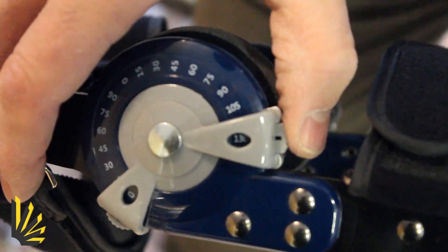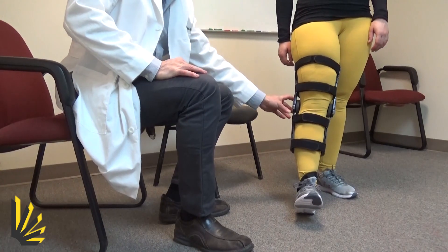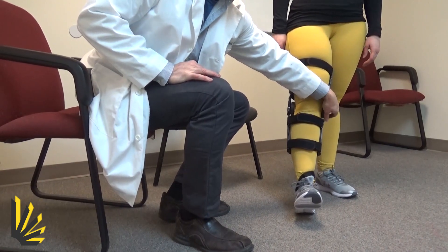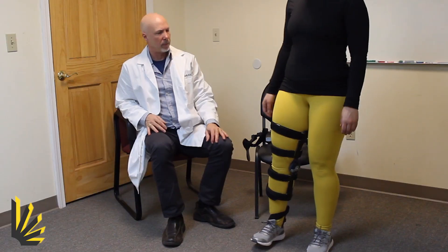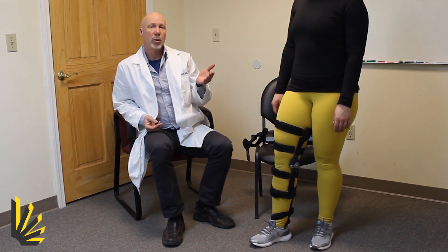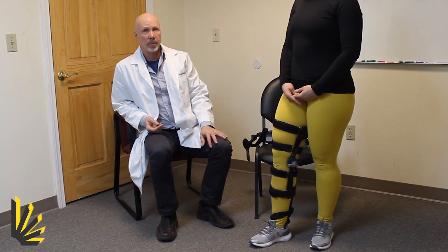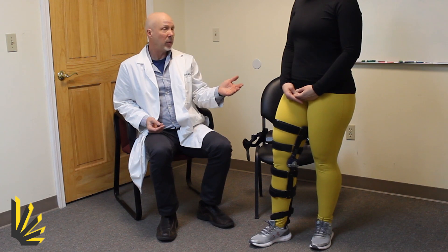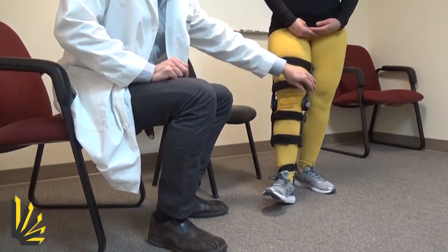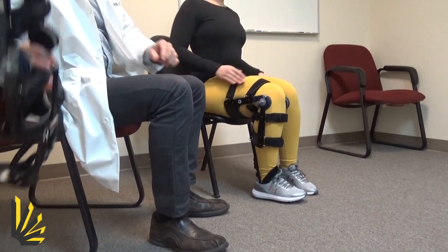To use the flexion stop, it's the opposite — just go ahead and extend your knee all the way. This would be for somebody who has knee buckling issues. We're extending it all the way and it prevents her from bending her knee. Go ahead and try to bend your knee. So for those that have knee stability issues and worry about their knee buckling, this would be the setting. Obviously you wouldn't be able to sit with this, so simply take the stops and move them so that you can sit — and she's ready to roll.